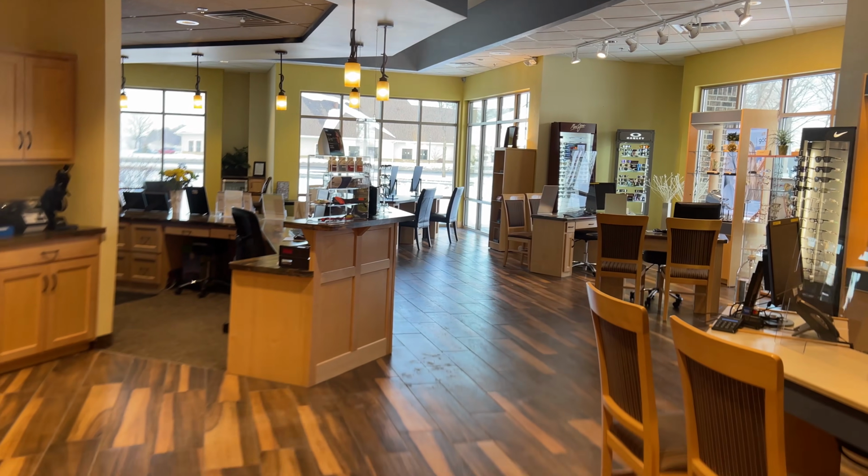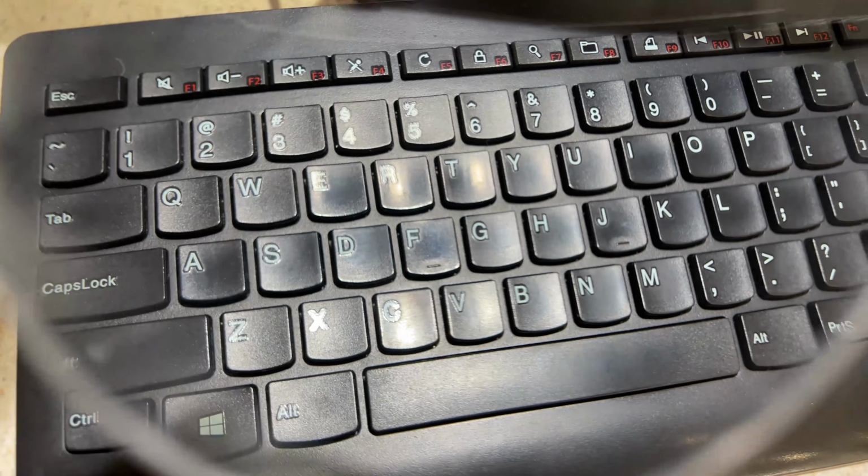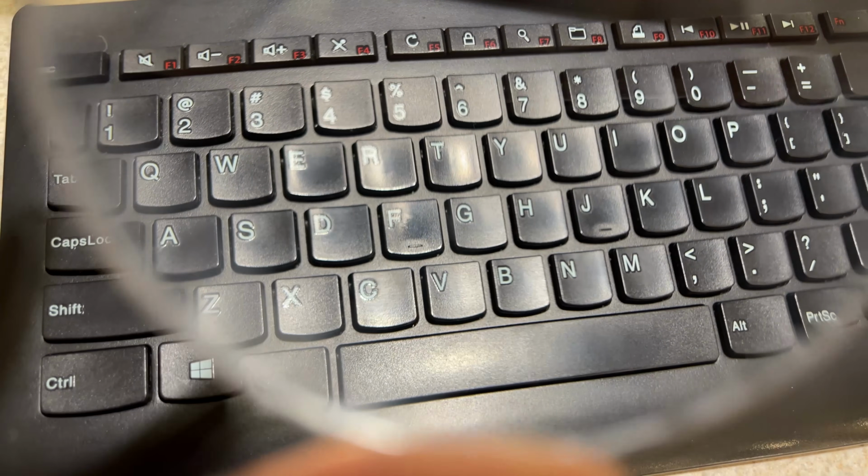And same thing goes for the intermediate distance, such as a computer. It's not far away, it's not way up close, but it's in the middle of the lens, and it'll just take a little bit of time to figure out that sweet spot.